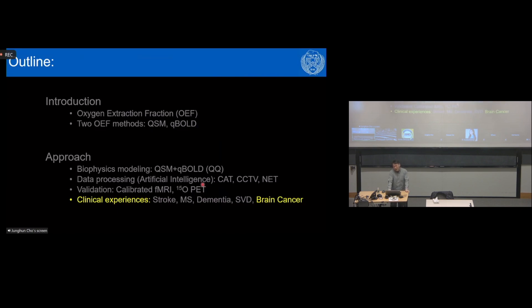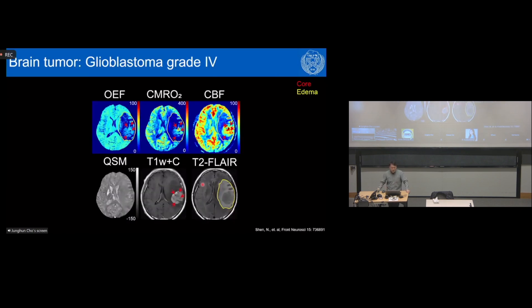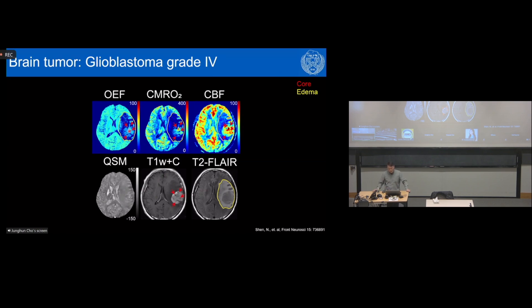Finally, brain cancer. In glioblastoma grade 4 patients, the tumor core shows substantially decreased OEF values, suggesting irreversibly damaged tissue. The surrounding edema (yellow contour) shows heterogeneous OEF values — some areas with very low OEF, some with moderate values, some near normal tissue levels. This heterogeneity is a core hallmark of brain tumors. This preliminary result suggests that QQ-based OEF mapping can be used to investigate metabolic abnormalities in brain cancer.